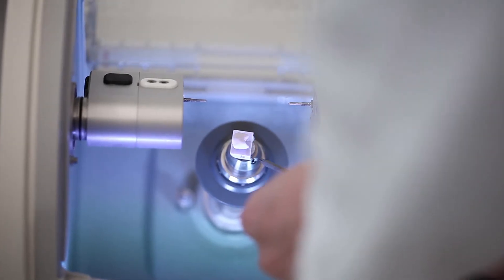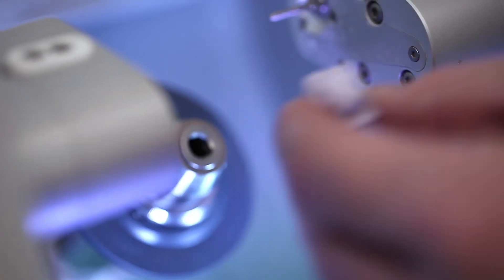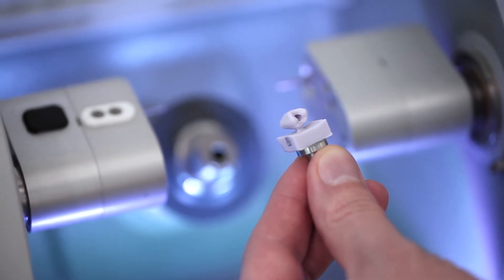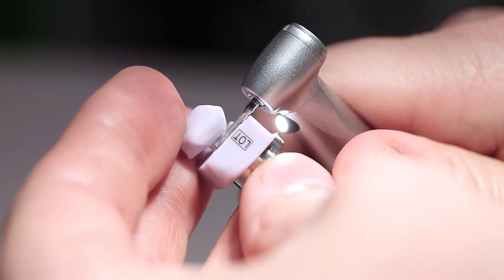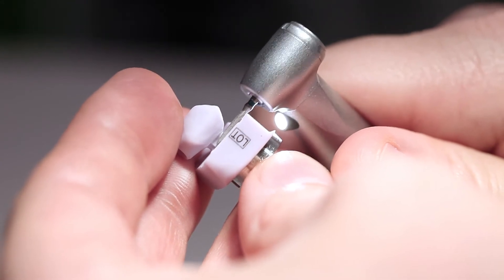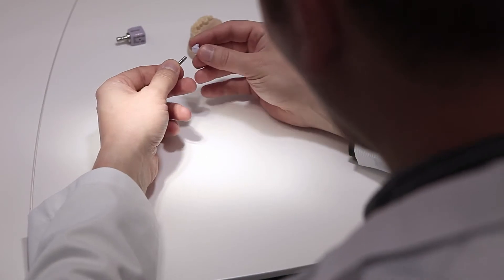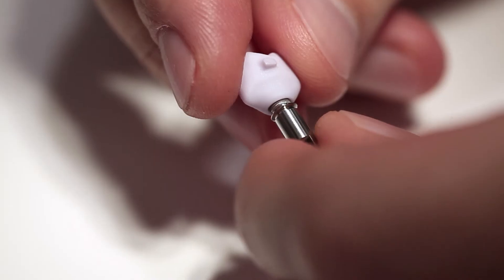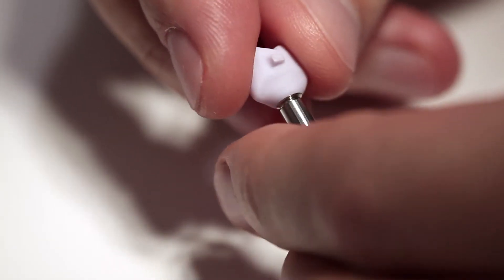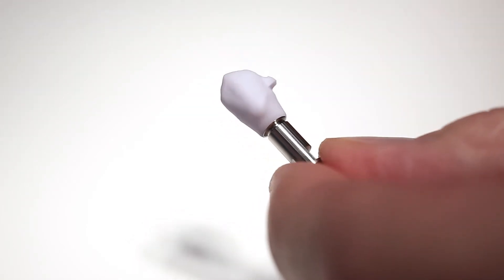Remove the milled IPS E-MAX CAD ceramic structure from the milling unit after the milling procedure has been completed. Separate the attachment point to the block with suitable grinding instruments, applying low speed and light pressure. Carefully place the ceramic structure on the tie base and check the fit. Note that you should not adjust the contact surface to the tie base, as this may compromise the fit.